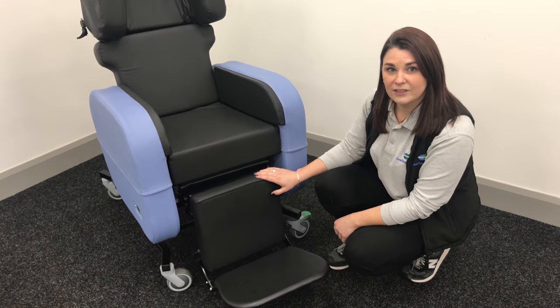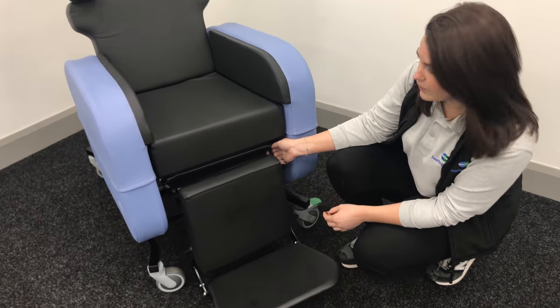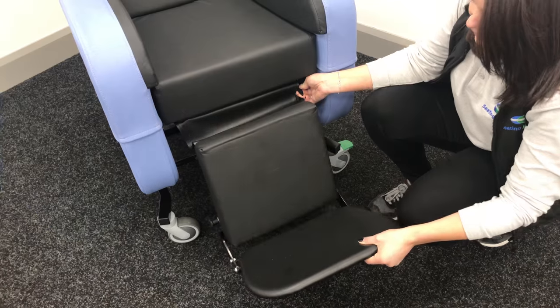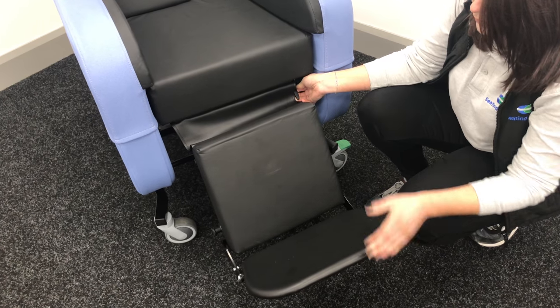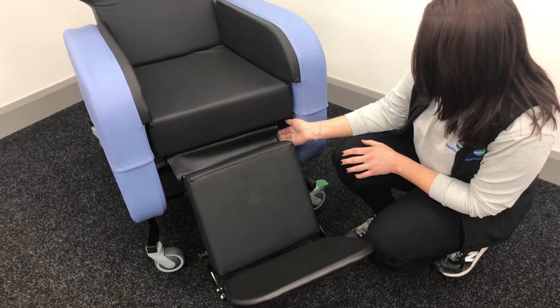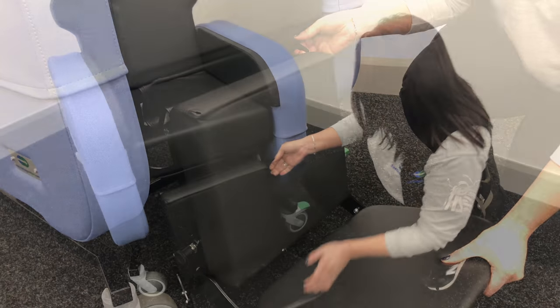If you need to adjust the angle of the leg rest, there's a little lever just in under the base of the chair. You just engage that and the leg rest will start to move up. So just get the angle that is required. To put it back down again, just do the same — engage the lever and push the foot plate back in again.